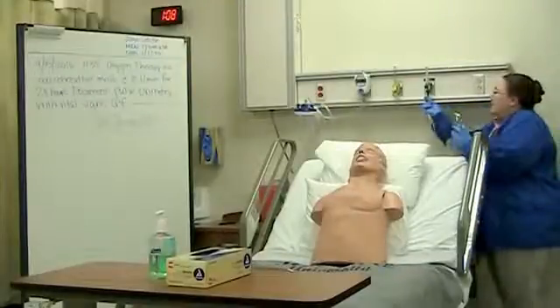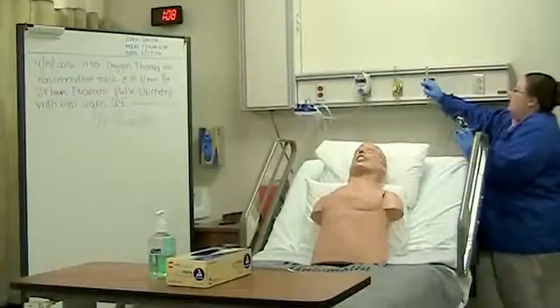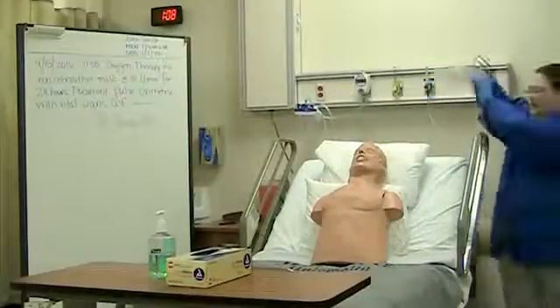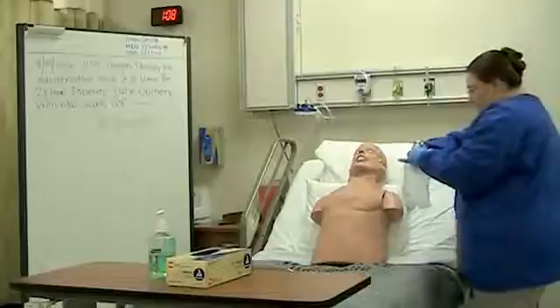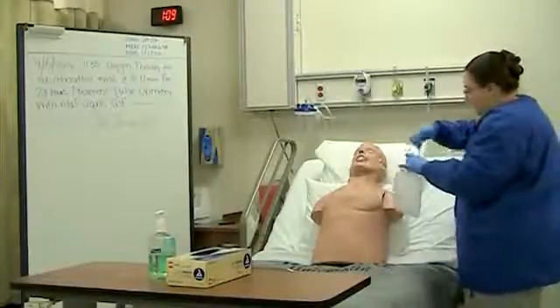I'm going to place the mask on the oxygen flow meter and turn the flow up to 15 liters per minute as stated by the physician's order. I'm going to make sure that the bag has fully inflated.